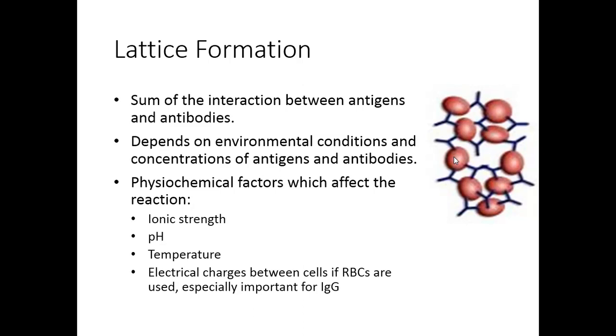The concentration of antigens and antibodies within the solution is going to have an impact. And when we talked about the electrical charges between red cells, we're going to talk about this again later, but imagine these are red blood cells. Red blood cells on their surface actually carry a slight negative charge that wants to push them away from each other. We have to be very careful in our test methodology that we overcome that.